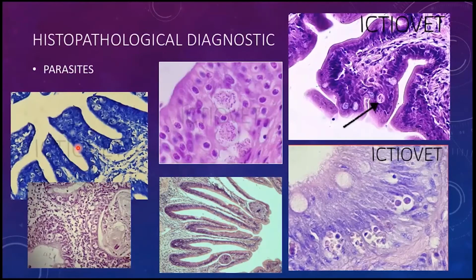We can see different parasitic forms affecting the intestinal mucosa, generally also producing an atrophy and inflammation of the intestinal mucosa itself. But we also have other parasites like Enterospora nucleophila, which is significant in some areas in the Mediterranean as well, and also produces a quite hyperplastic response of the mucosa with quite significant inflammatory infiltrate involving macrophage aggregates in the submucosa as well.